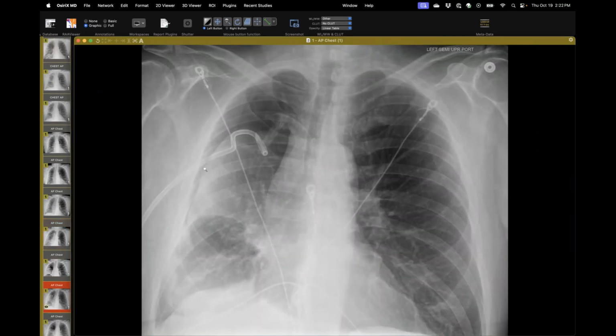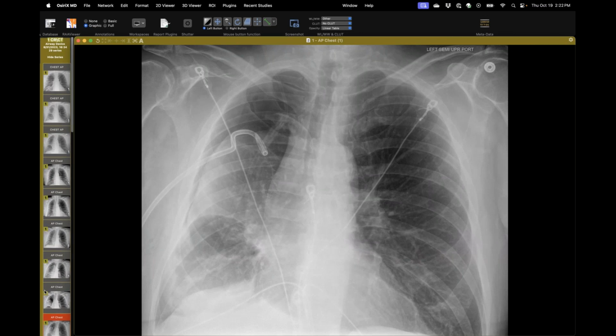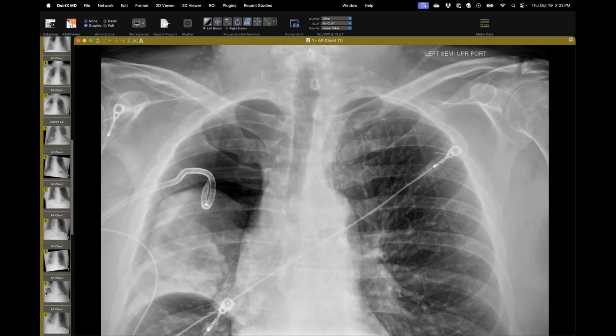What's interesting is that the pneumothorax not draining also favors an ex vacuo phenomenon. You can see that the right upper lobe is opacified, presumably because now we've occluded it and it's trying to collapse down, but it's unable to. So long story short, he's been hanging around here for a couple of weeks. Here's another one, showing just that dense, now consolidated lobe. There are the valves.